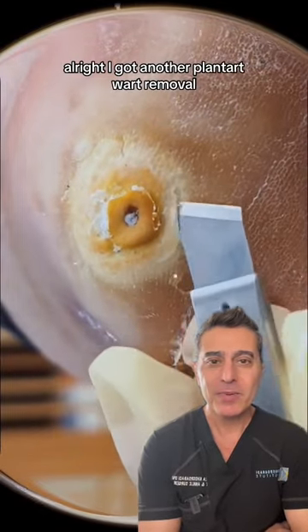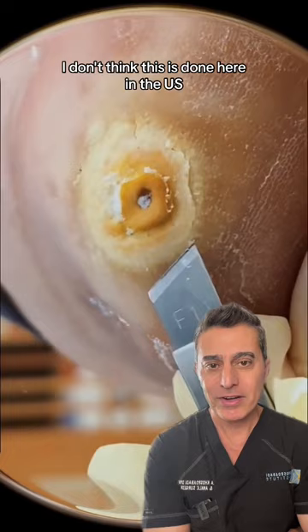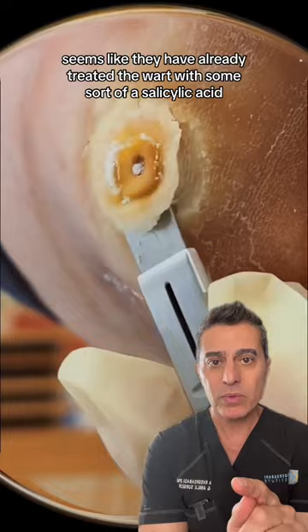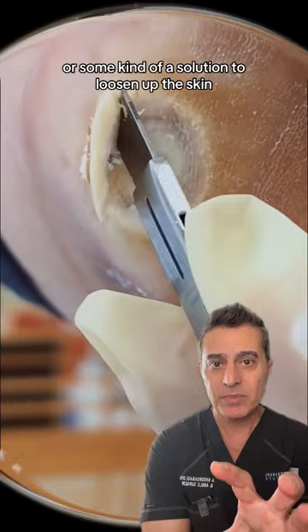All right, I got another plantar wart removal. I don't think this is done here in the U.S. because I am not familiar with that kind of a blade, but at least they're on the right start using gloves. It seems like they have already treated the wart with some sort of a salicylic acid or some kind of a solution to loosen up the skin, and they're removing all the dead skin so far.